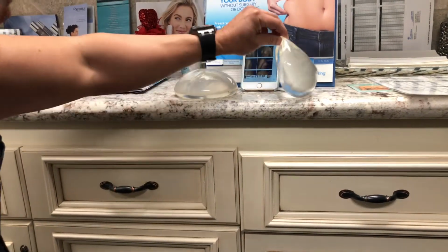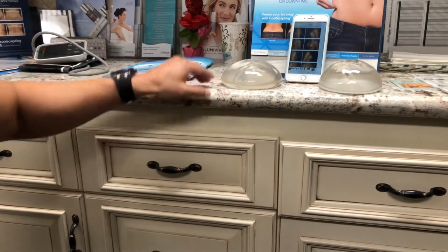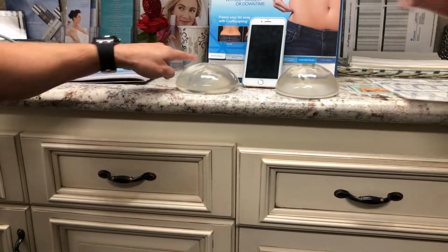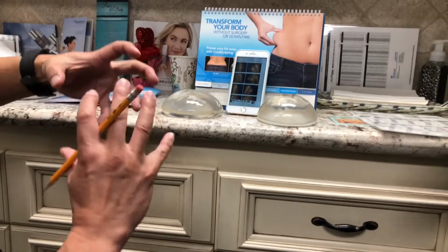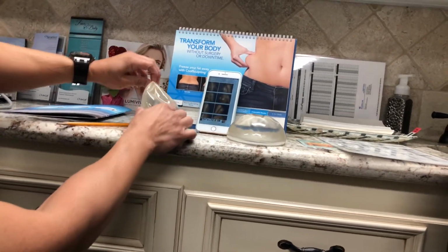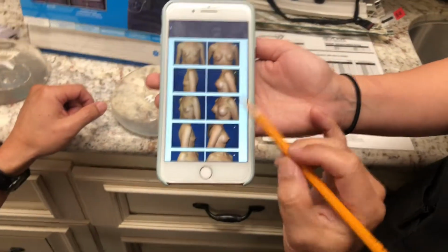So when we sit it up like this, you'll have a softer upper pole transition. Let's now go to this one, which you can see is less projection. It's not going to project as much as this one, but it's filled more, and you see it's not shelving as much, so this we can consider to be more of a medium cohesivity. It's a little bit stronger, and when we sit it up, it's going to fill the upper pole a little bit more. She's wanting a little bit more of this right here, a little bit of fullness and that cleavage right there.